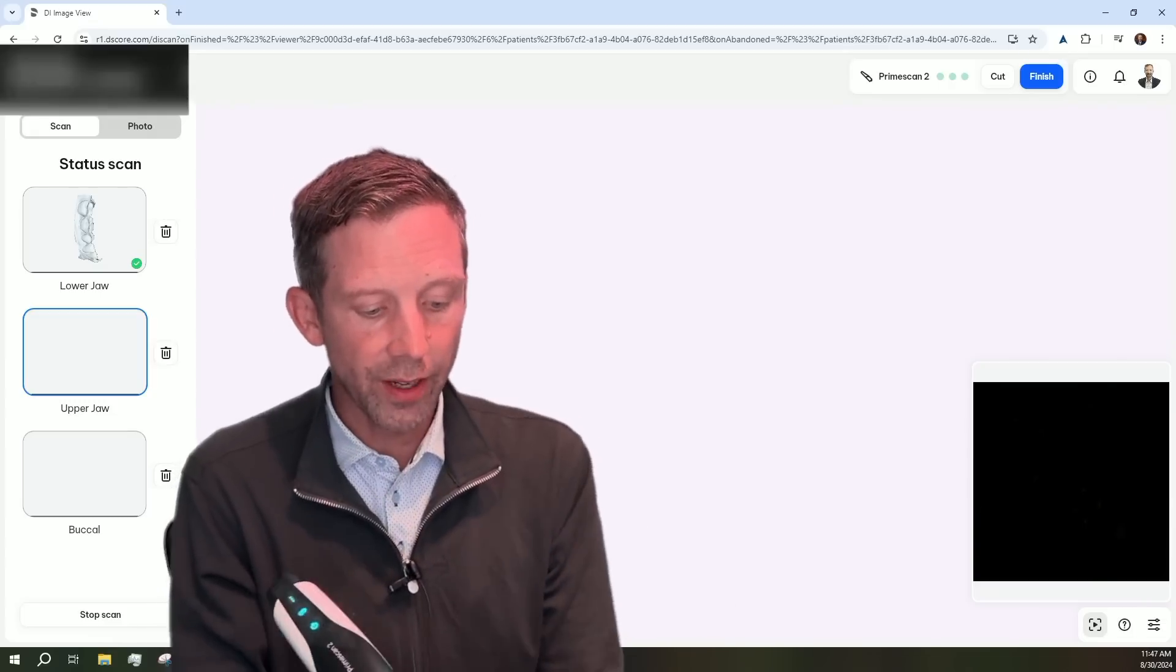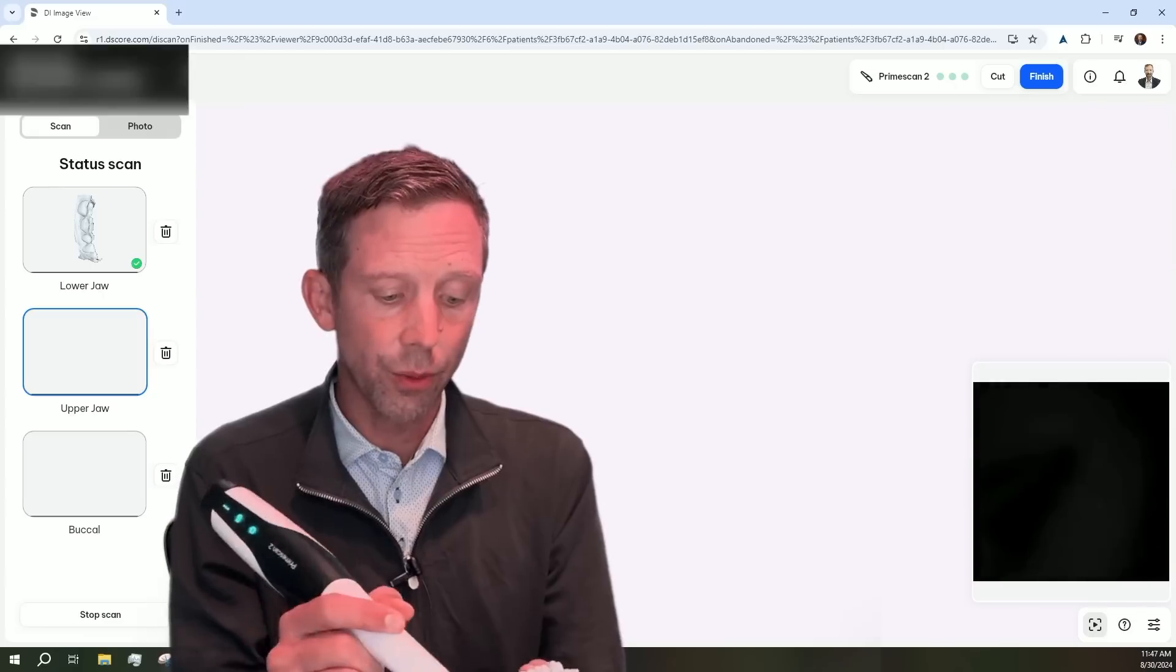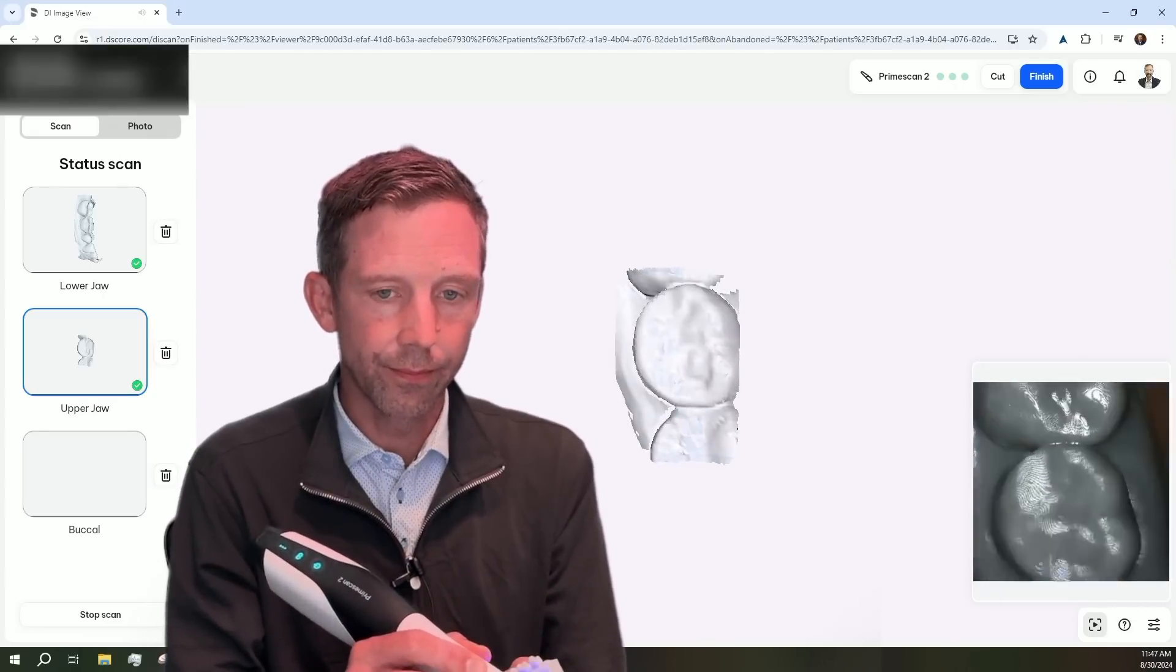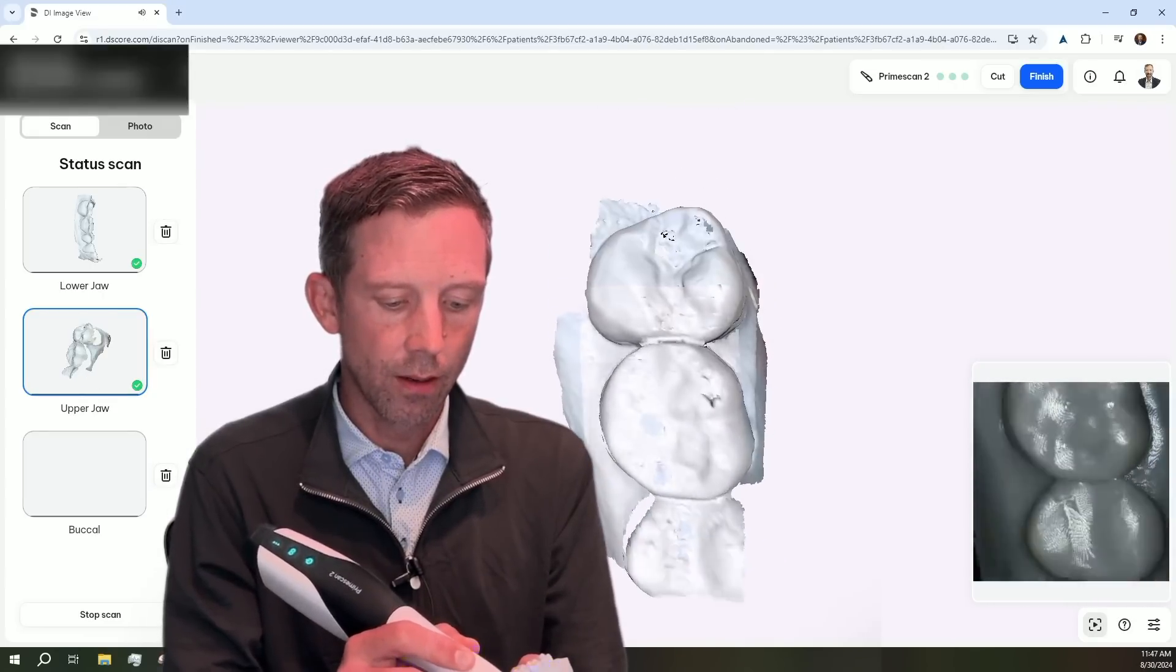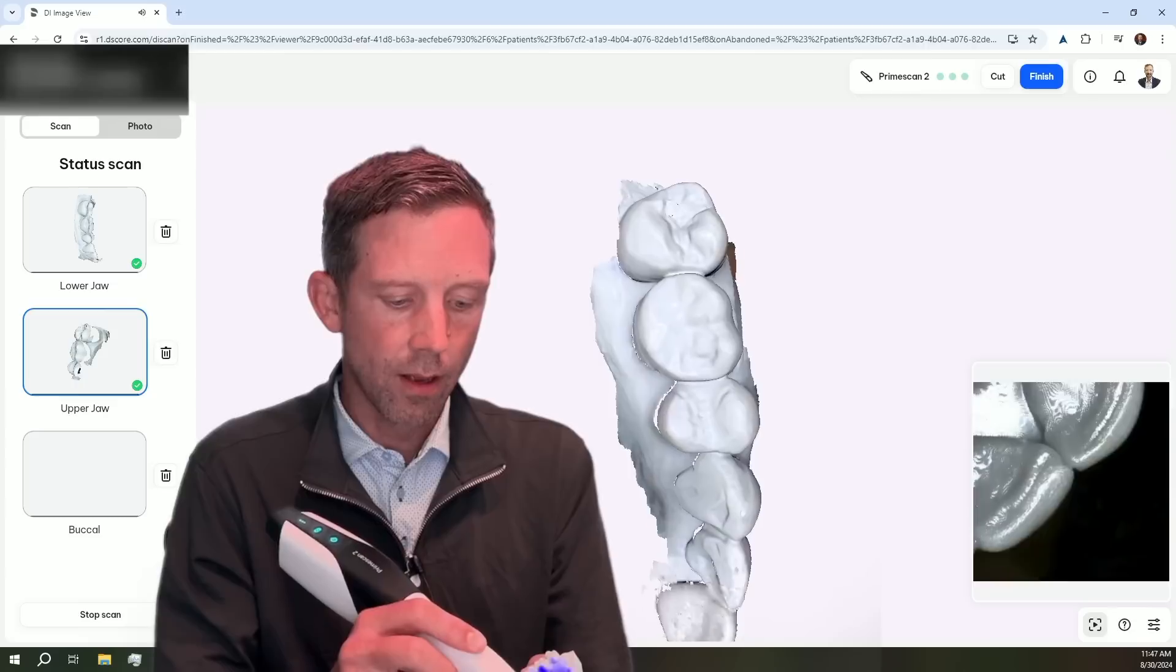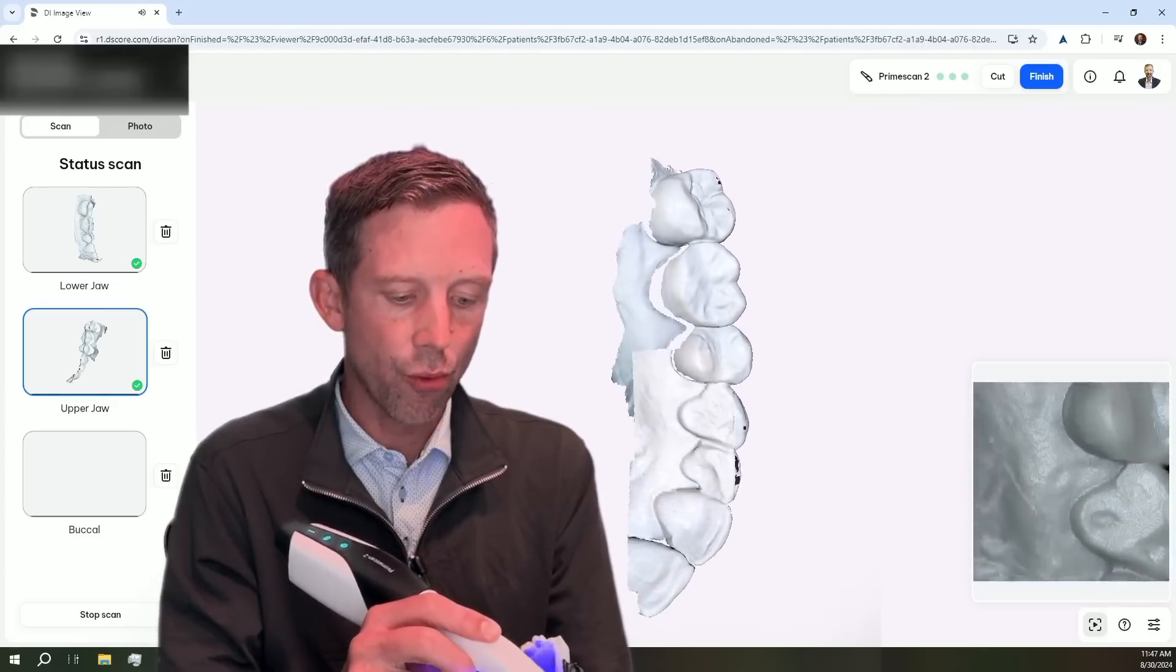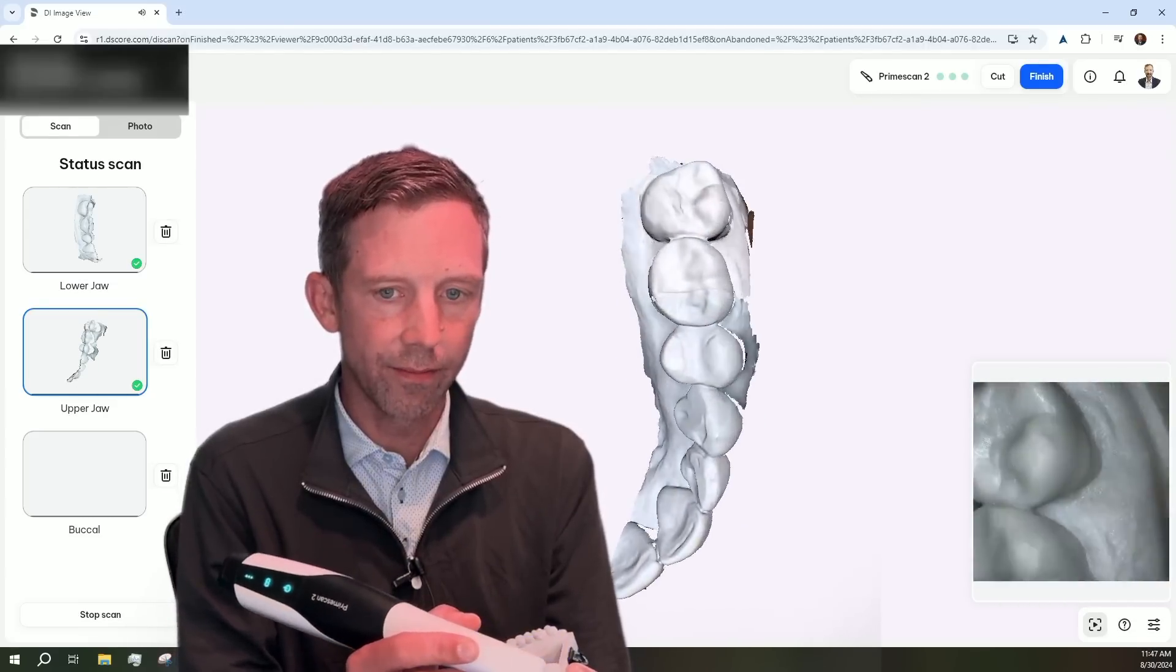So now we're going to go ahead and bring up the upper arch, and we'll go ahead and scan that quadrant. And again, uploading directly to the cloud as we scan.